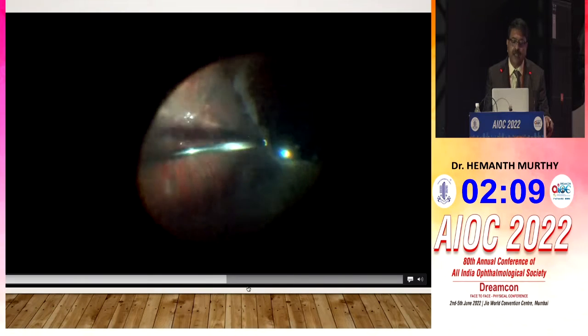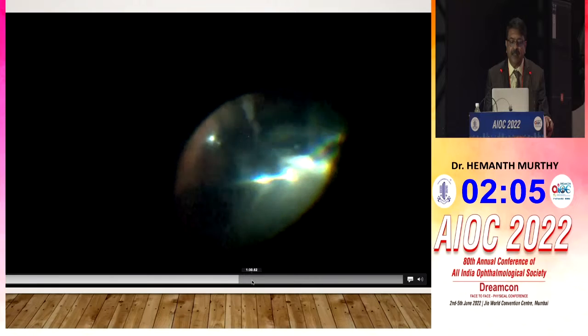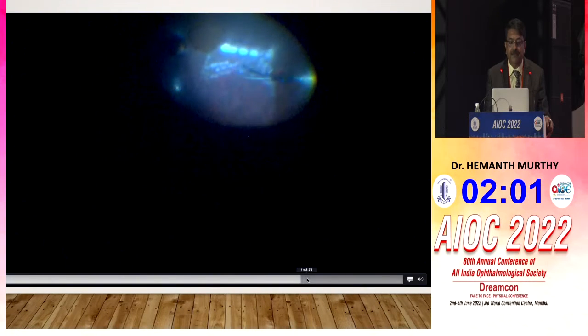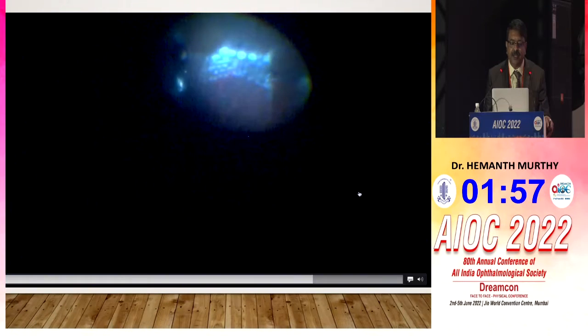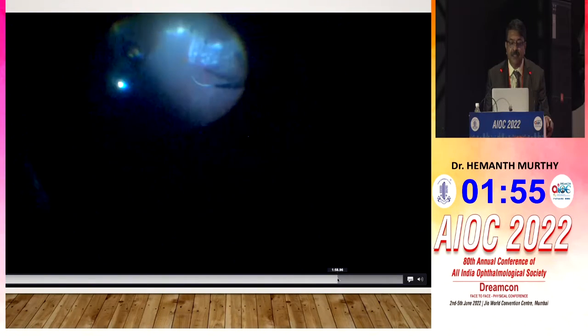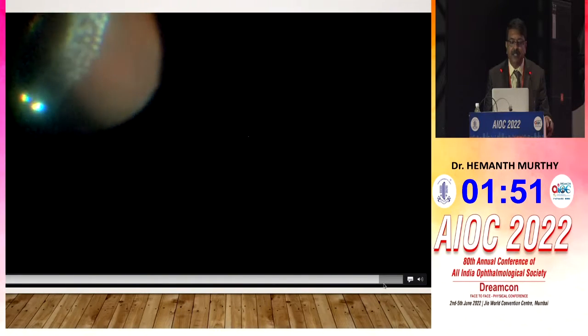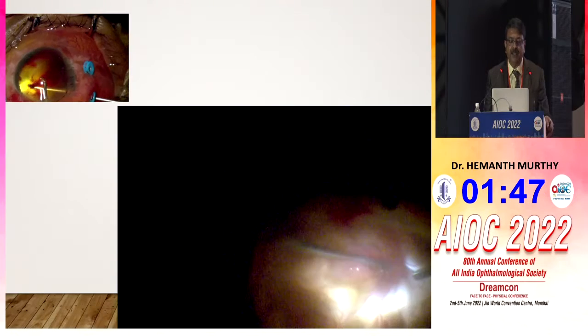The patient had large tears in both nasal and temporal quadrants. So I ended up doing a bit of retinectomy, joining these two tears, and I could ensure a flat retina. So PFCL really is helpful whenever you do resurgery, to give you stability of the retina.